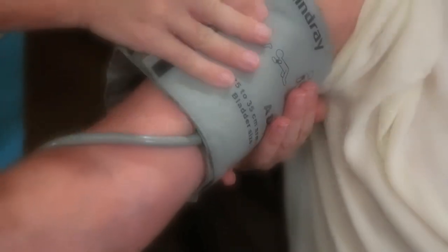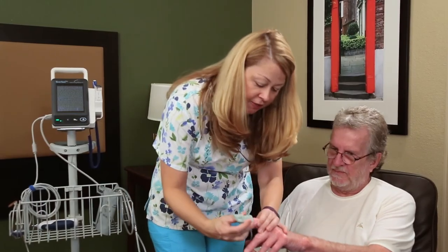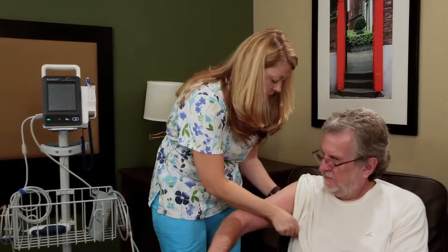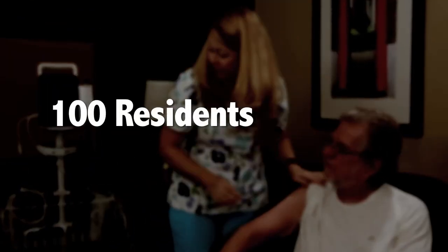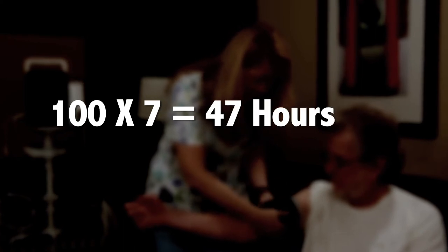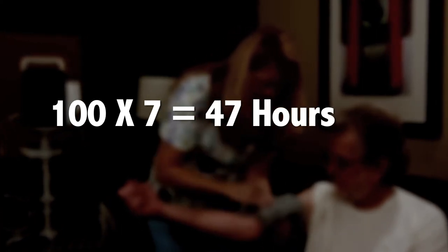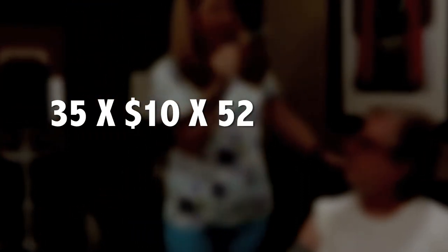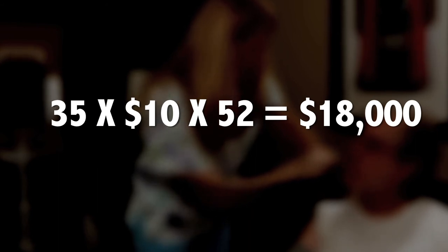Regarding return on your investment: it takes an average of 4 minutes to manually take vitals per resident in a long-term care facility. For a facility with 100 residents, manually taking vitals once per day for 7 days will take a total of 47 hours. Rosebud VC can take vitals in less than 1 minute per resident, saving a 100-resident facility 35 hours per week. At $10 an hour, Rosebud VC can save you around $18,000 a year.